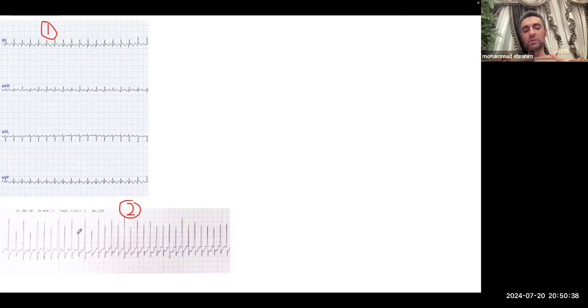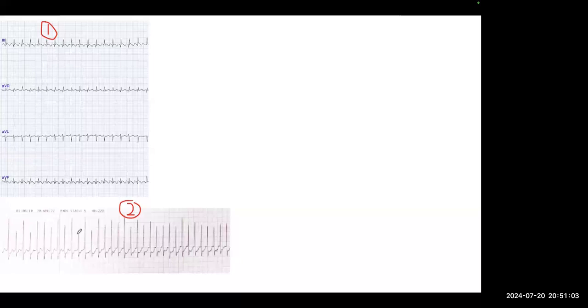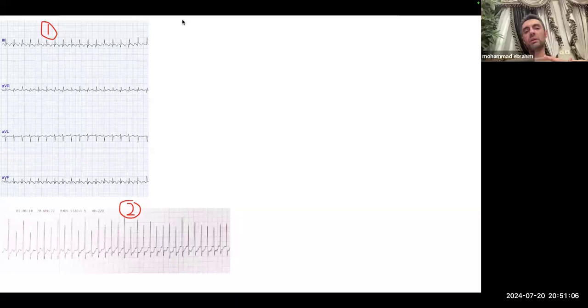Yes, you cannot really see a nice, distinct, convincing P wave before a QRS. You can imagine it, but if I ask you whether you obviously see P waves, are you so sure? You probably say no. Furthermore, the sinus rate exceeds what you would expect. I'm not telling you the age of the baby, but regardless it's above 220. So both examples are SVT ECGs, right guys?